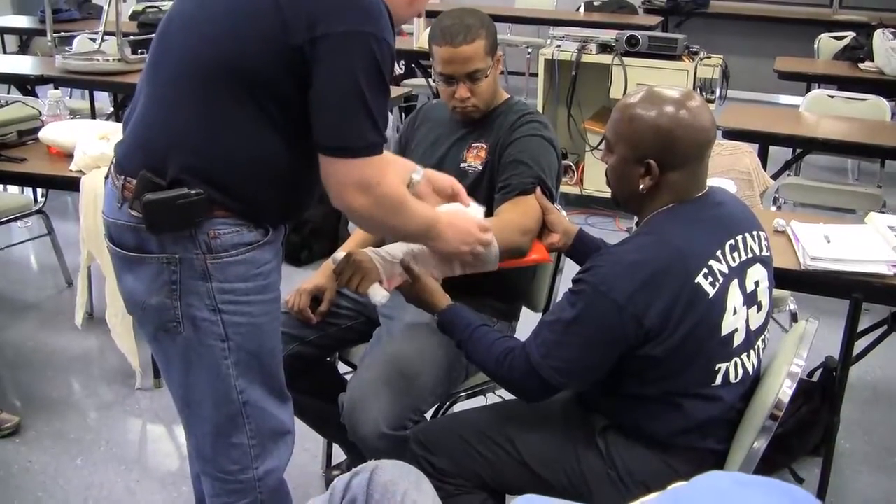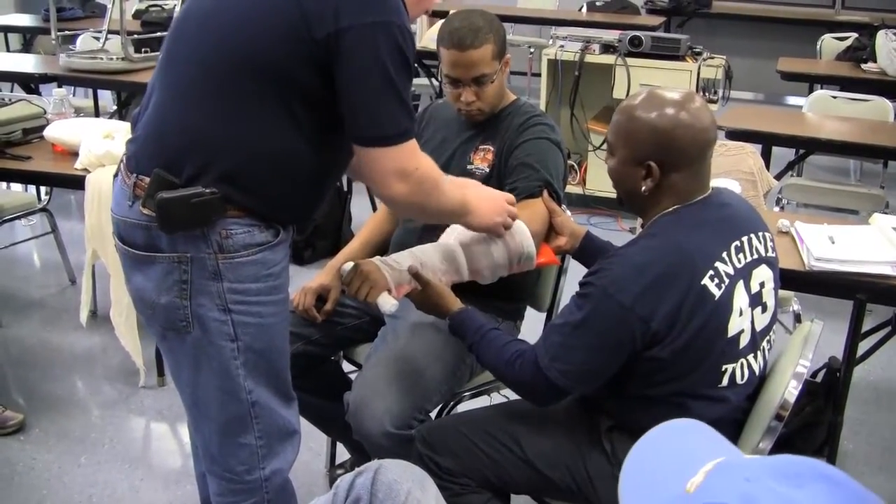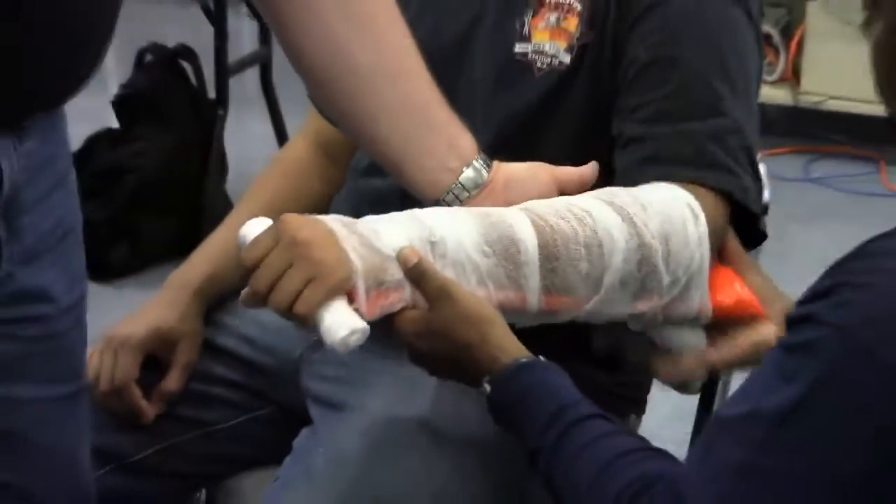I'm not going to need this whole roll. Let's say we wrapped it all the way up nice and tight.